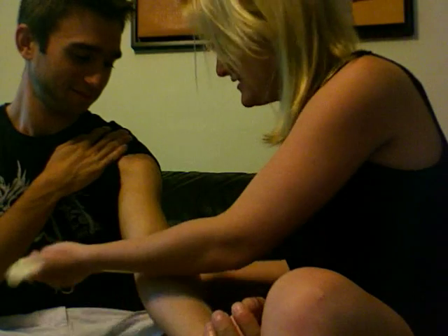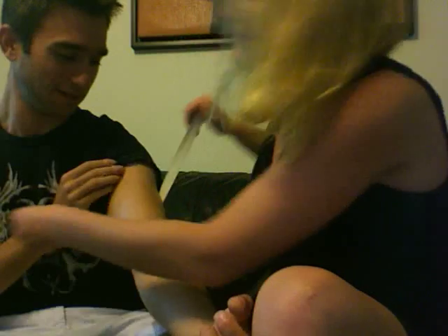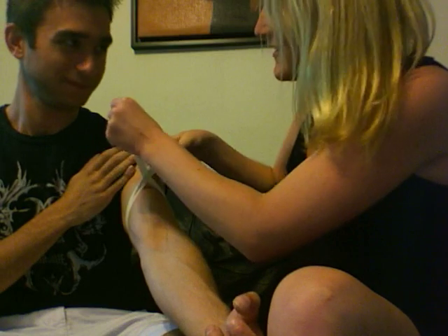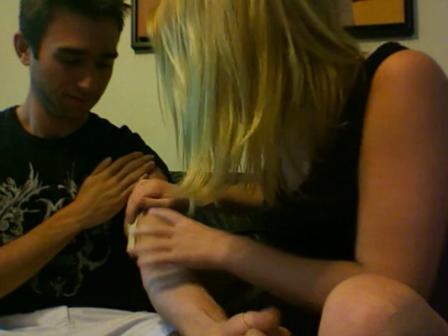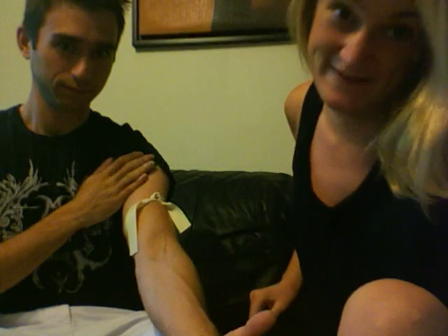So this is a tourniquet. I'm going to wrap it — okay, higher, I'm going to wrap it higher. All right. Oh cool, look, that one's popping. And I can see his vein popping. Yep, you can see it from there.